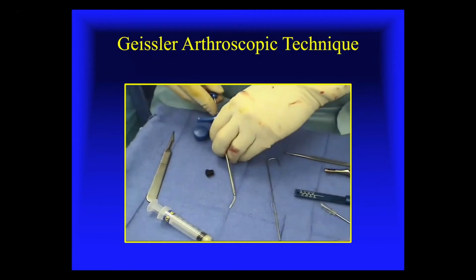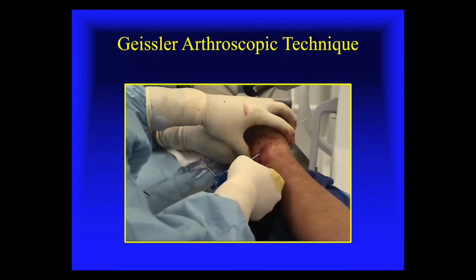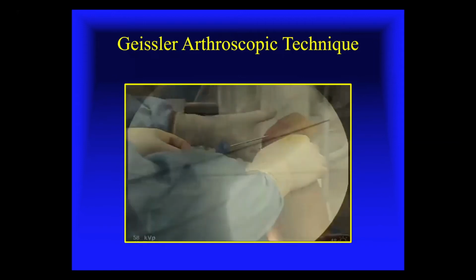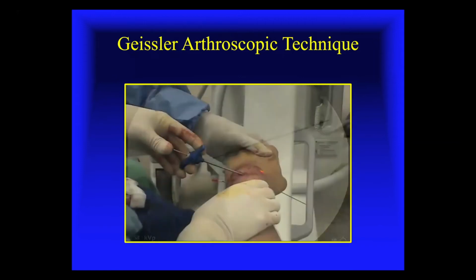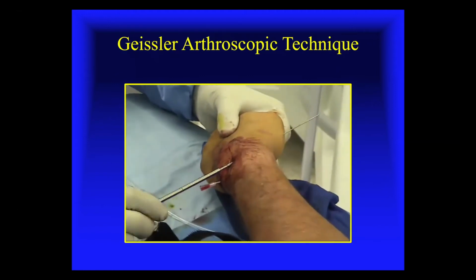So as you put it through a bone biopsy needle, it comes out in a cylinder. We'll just place it over the guide wire. We'll check its position. We push till we get resistance and place our screw.